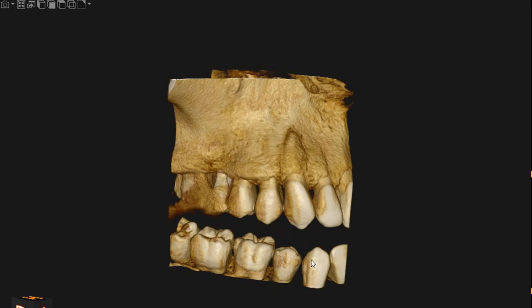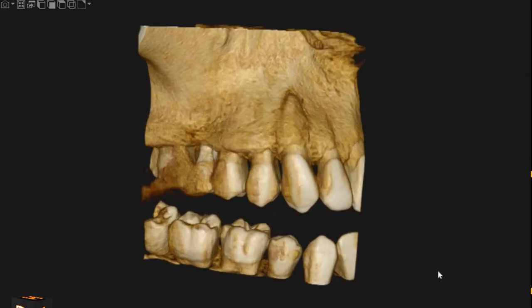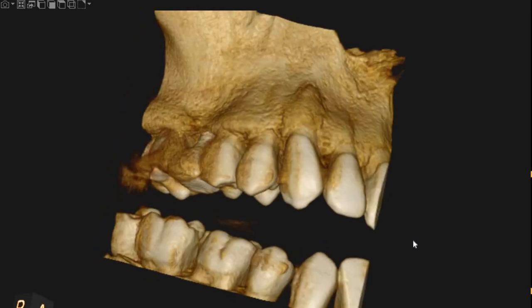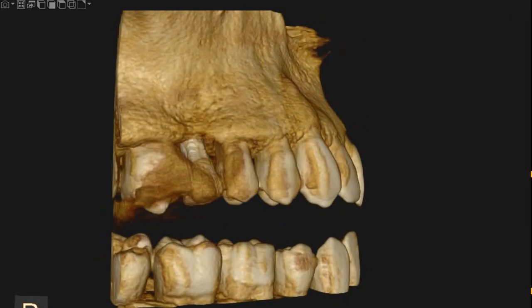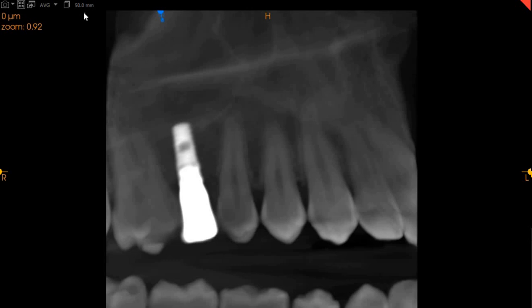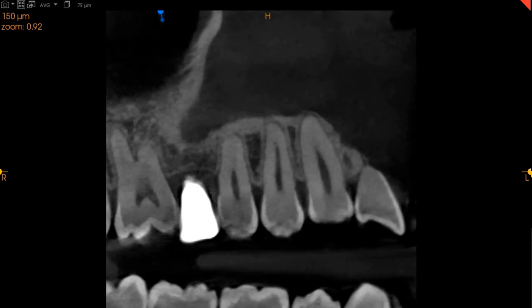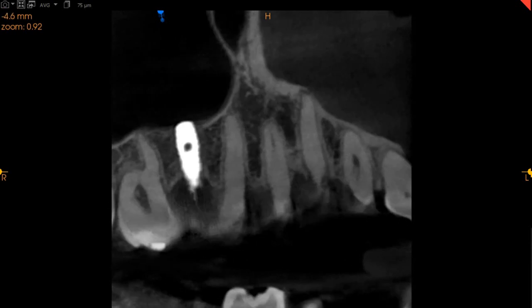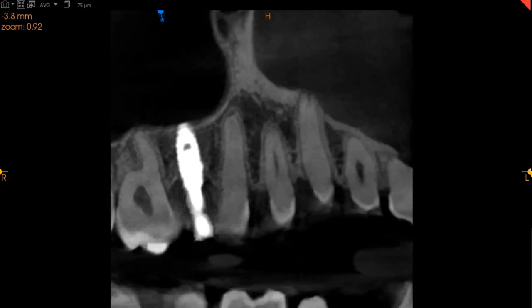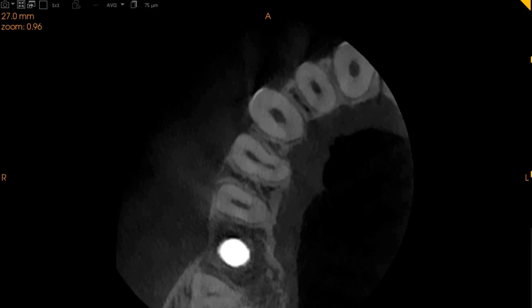Hello and assalamualaikum. Ultrascan Diagnostics here. This is the CBCT of the patient that you had requested. The area of interest is the upper right second premolar implant. This is the sagittal view — as you can very clearly see, the sagittal view has an implant placed and we can see good bone support around the implant.